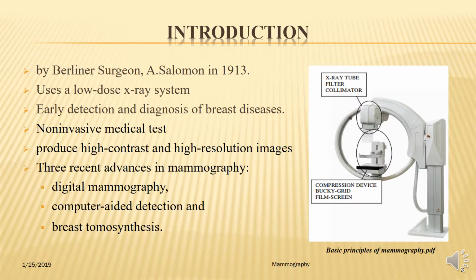There are three recent advances in mammography: digital mammography, computer-aided detection, and breast tomosynthesis. Digital mammography, also called full-field digital mammography, is a mammography system in which the X-ray film is replaced by electronics that convert X-rays into mammographic pictures of the breast.